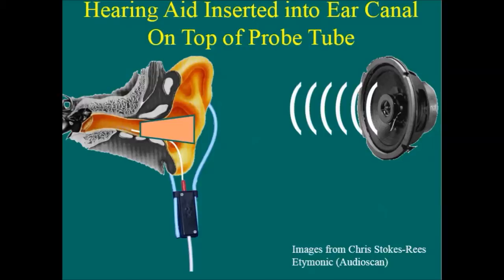On the screen, you'll be able to see the person's hearing loss, and then you'll be able to see average speech, unaided, and then you'll be able to see speech aided, and you can visualize the difference between aided and unaided speech. You can see what the client's hearing. So you're able to prove, are you getting what you said you'd get?